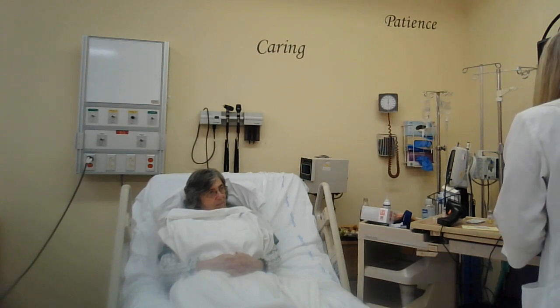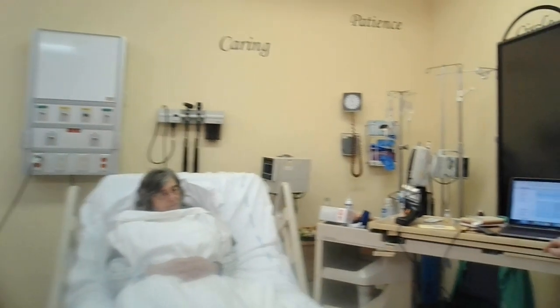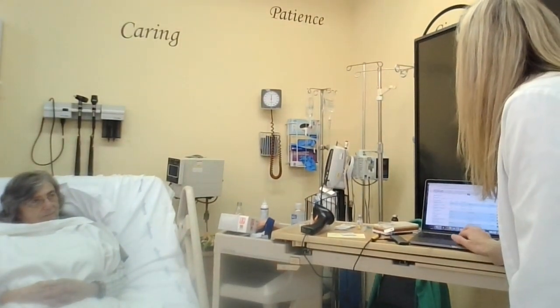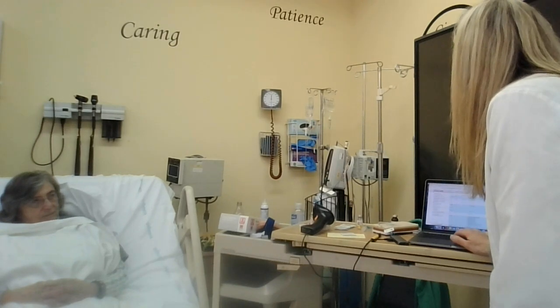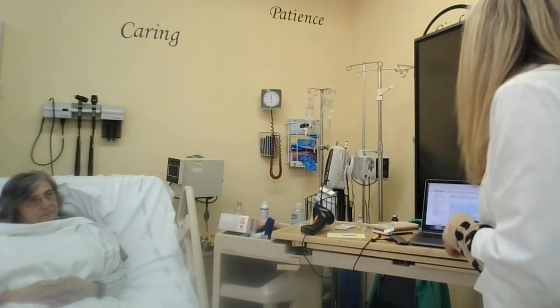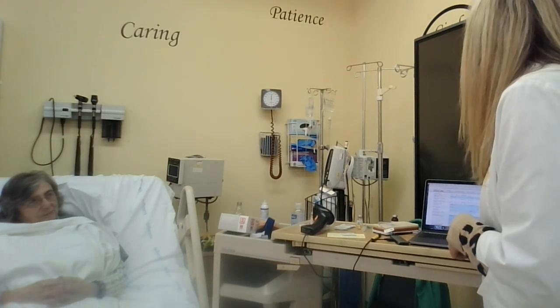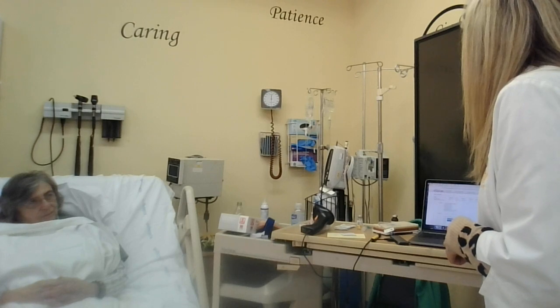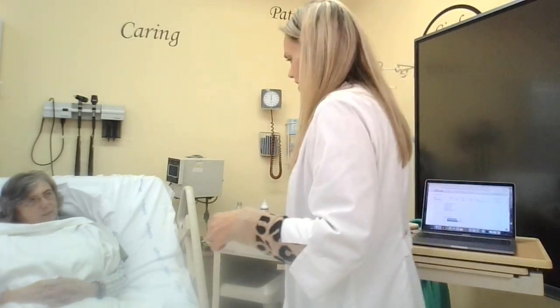Okay, so I'm going to go ahead on DocuCare, if you can see, and I'm going to click on my first sub-Q medication. Okay, so I know that they just came in and checked your blood sugar and said it was 200. So we're going to be administering a little bit elevated today. Yeah. So I'll give you a little bit of insulin before you have your lunch. Okay, so let me go ahead and scan your band.